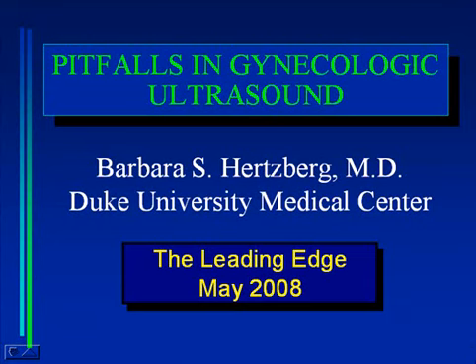During the course of everyday practice, my colleagues and I have all too frequently encountered cases in which our feeling after initial scanning is, "I've got it, I know exactly what's going on here," only to learn, much to our dismay, that "I got it" can mean a lot of different things. And yet it's precisely these types of cases that tend to be most instructive. So it's my hope that by sharing our misses and near misses with you, we can help prevent you from falling into the same traps.